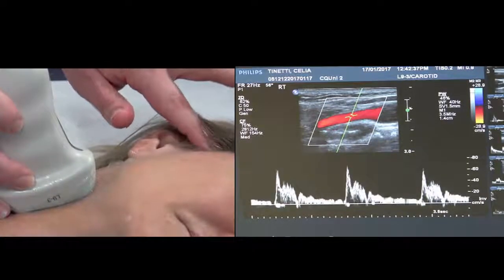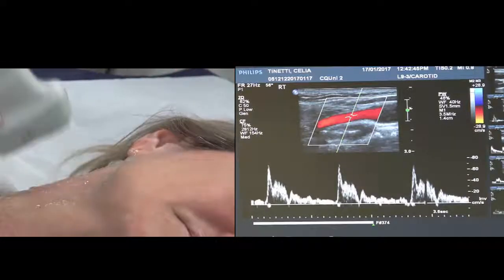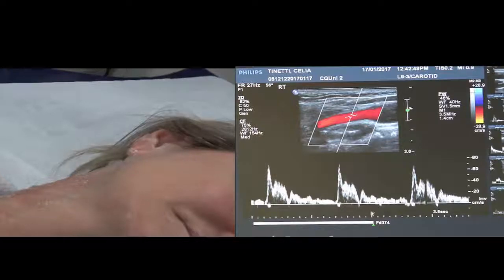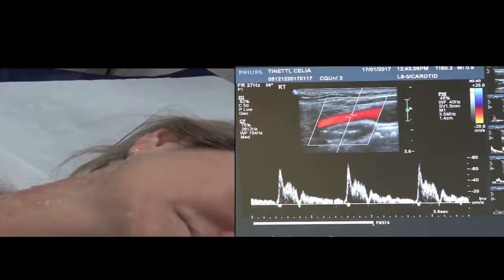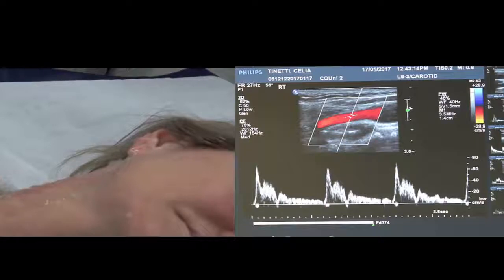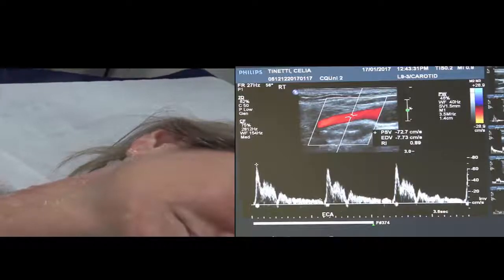Not too far from the bulb — if it's a nice clean trace, you need to be as close to the bulb as you can. Update — I'm actually half leaning over already in preparation so I don't move my hand. Make sure you've set it so it's right. Have a test — see the little jiggle? Press freeze. You can see the temporal tap here — it's not in an earlier one. Use your cine loop; you cannot measure on a temporal tap. You can see the runoff is beautiful and here it's jolted. Don't do it leisurely because otherwise you'll have three traces with temporal tap and won't be able to image. There's your temporal tap — that one's nice and clear. So I'm going to image here, not to the dip. ECA — and then remember to label TT for your temporal tap.